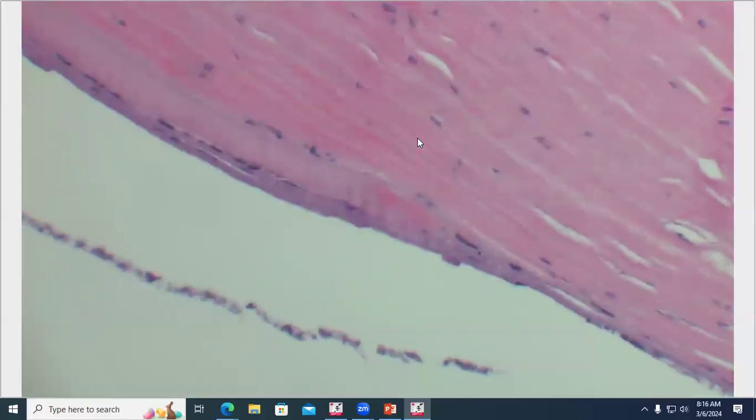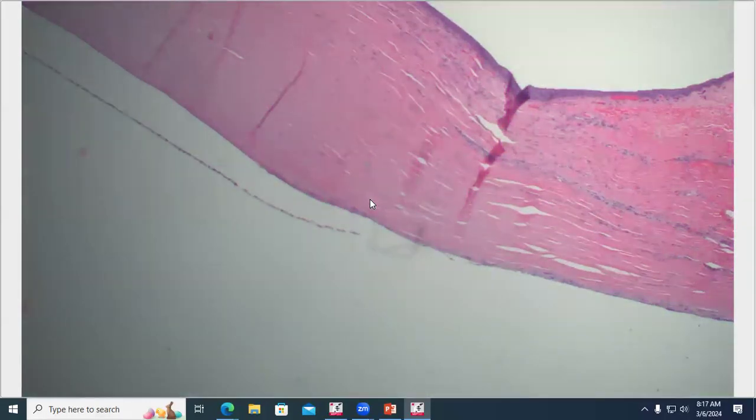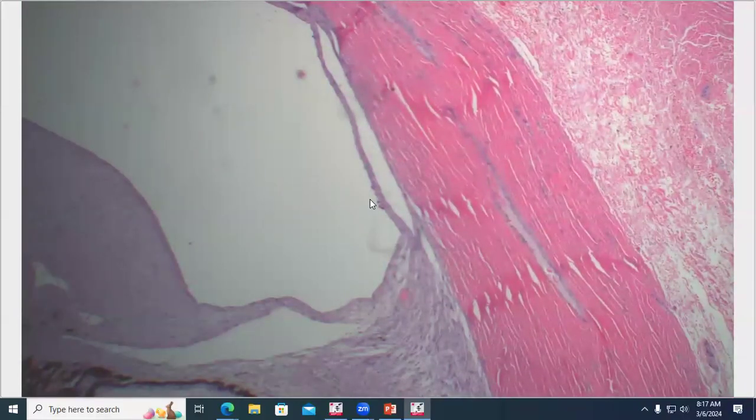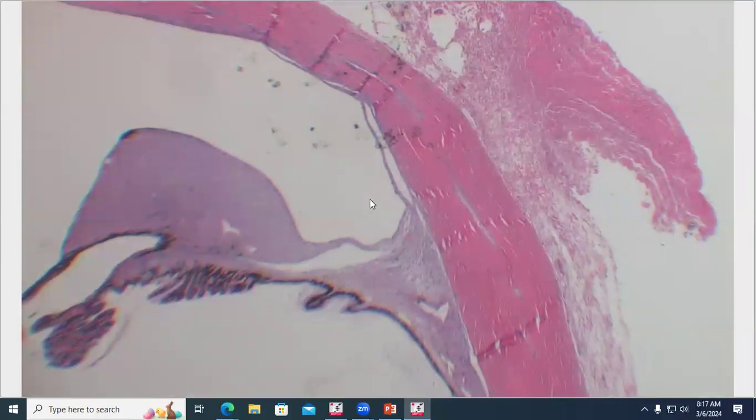On this side in particular, I said that there was iridocorneal angle recession. Let's see here. So this is an end of Descemet's membrane. I'm not sure if it's a broken end or the actual anatomic terminus. But if you keep your eye on that spot at a slightly lower magnification, and then we travel down to where the base of the iris is, it's greatly posteriorly displaced. So this is iridocorneal angle recession. This could be due to trauma, like cyclodialysis. Blunt trauma is usually what causes that, or it could be due to just neoplastic distortion of the architectural features of the structures in that area. I'm not sure which it is in this case. So we always consider trauma to a blind eye to be a reasonable thing to suggest. I don't think clinicians and owners necessarily like to hear that, but I think it's something that Dr. Colitz says all the time.